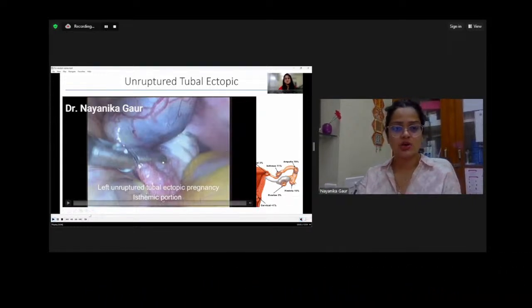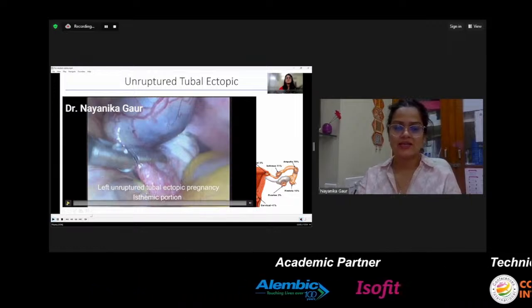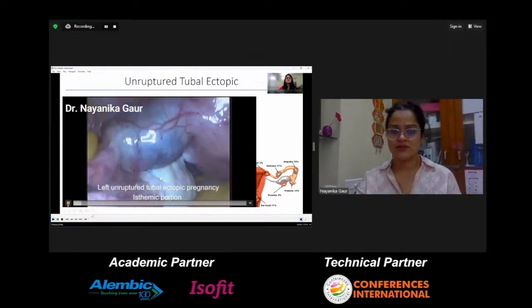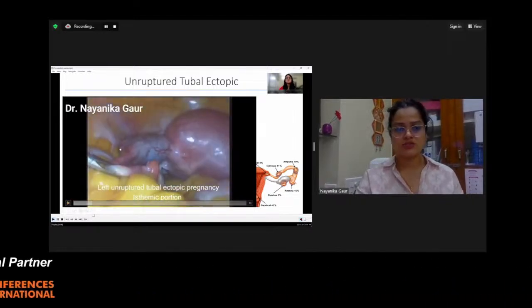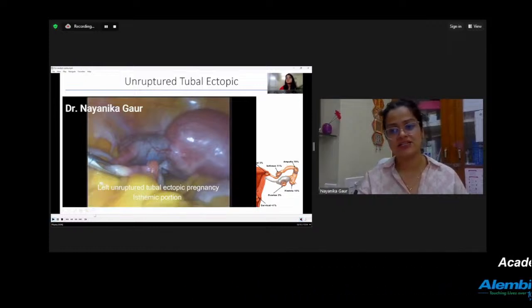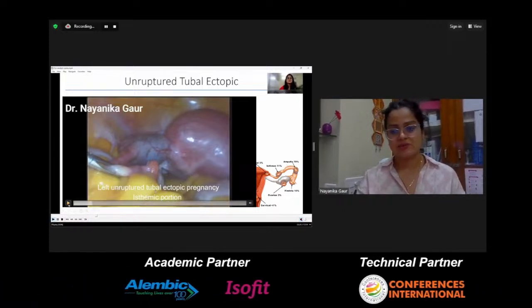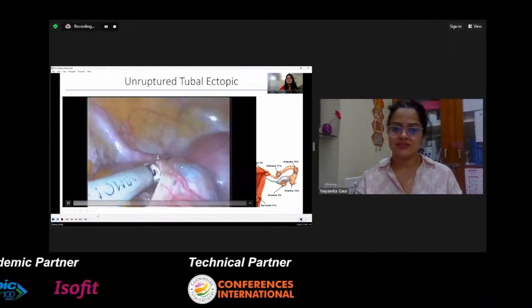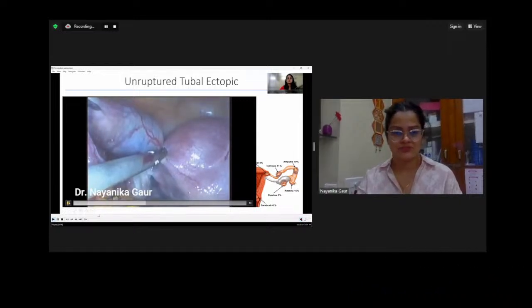And this is another video, of an unruptured tubal ectopic pregnancy. Here I will be demonstrating the isthmic portion of the tube where the pregnancy had developed. This position is actually the isthmic region of the tube, which can be demonstrated by the diagram on the side. Again, this is an unruptured ectopic pregnancy, and therefore there is no blood in the cavity.